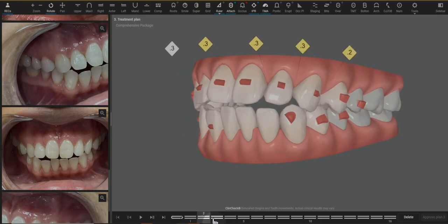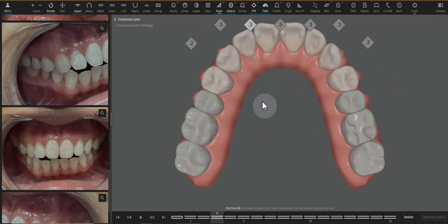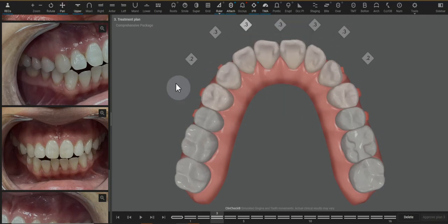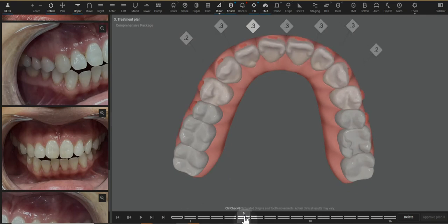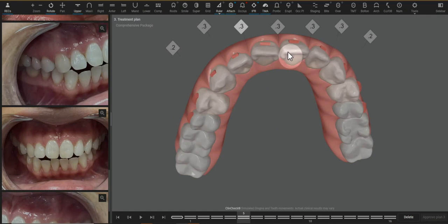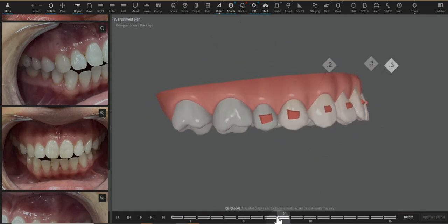The vertical aspect is solved with the extrusion attachments. To reduce the flare, we do need to do IPR. If teeth were all lined up in a straight line, we could take these anterior teeth that are tipped buccally and tilt them all back without needing IPR — but we are in an arch. When we tip the incisal edges back, we're essentially reducing the size of the semi-circle we're working with, so IPR is needed to help reduce the buccal flaring of these teeth.